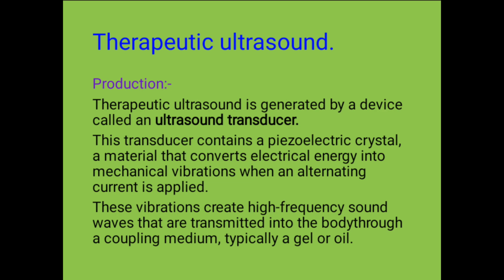Yeah, those are some of the examples of piezoelectric crystals. So basically, when you are told to describe the production of ultrasound, then you need to mention the ultrasound transducer. Then you expound more on the piezoelectric effect and even the reverse piezoelectric effect. You need to majorly dwell on those things.